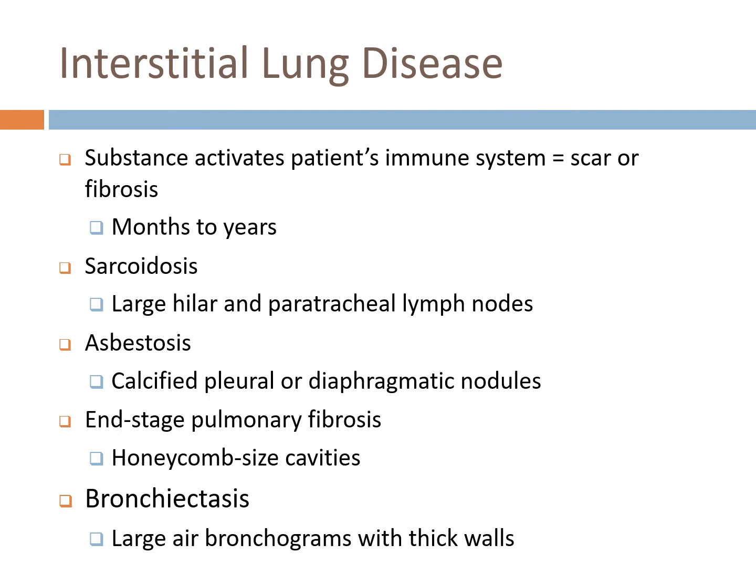A lot of times these types of patients are going to need maybe an EBUS or a different type of bronchoscopy to get some lung tissue to actually diagnose what they have. Occasionally they may have to do a video assisted thoracoscopy, or they call it a VATS, where they actually have to do more of an open lung biopsy to diagnose these patients.